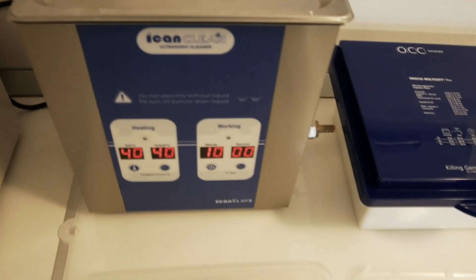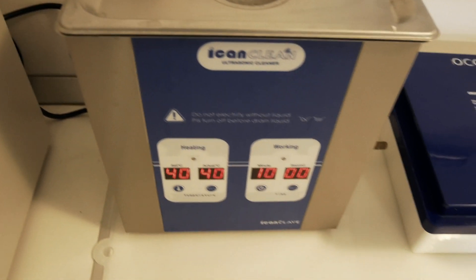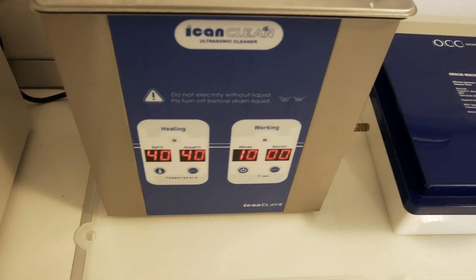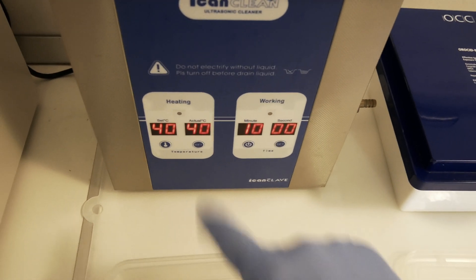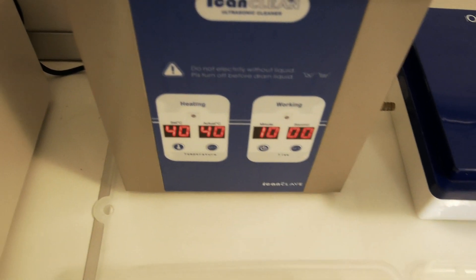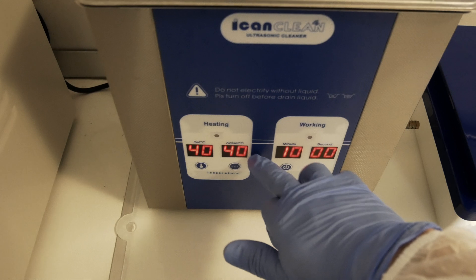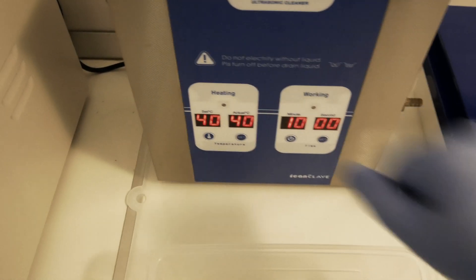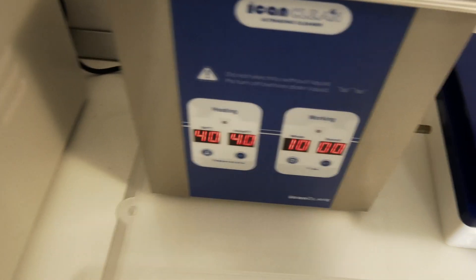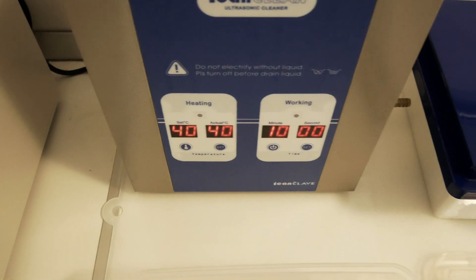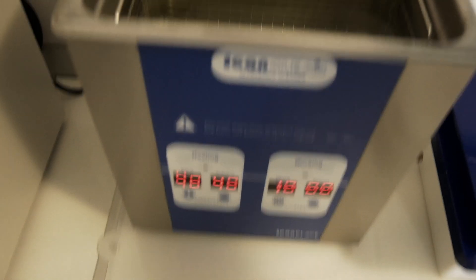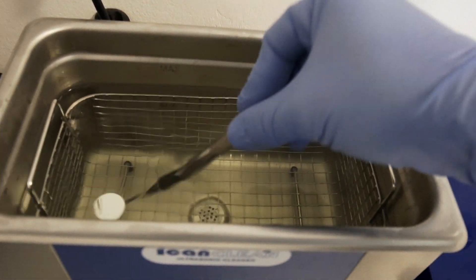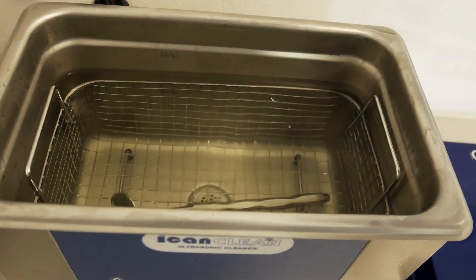It uses an enzymatic cleaner and it's special for use in an ultrasonic cleaner. In this case, I'm using Micro 10 Plus from Ecolab in the concentration the producer specifies. I'm using an ultrasonic cleaner with temperature control. I'm using a 40 degrees Celsius program for 10 minutes. So let's insert the instruments there. When you insert them, be careful not to splatter.